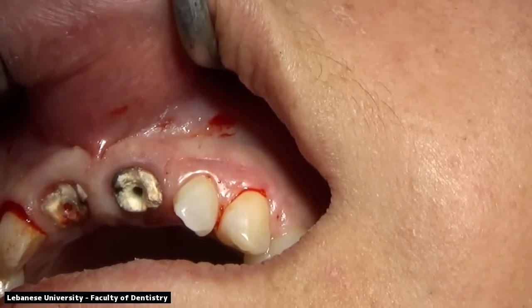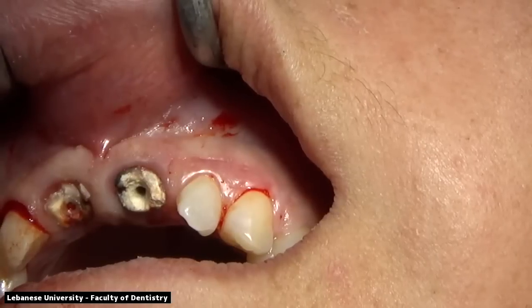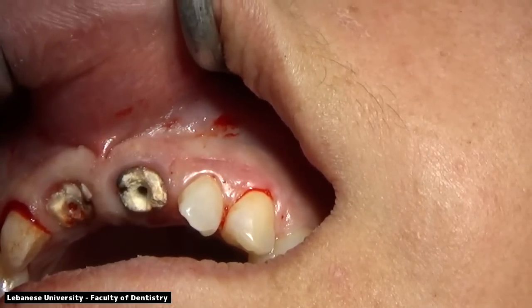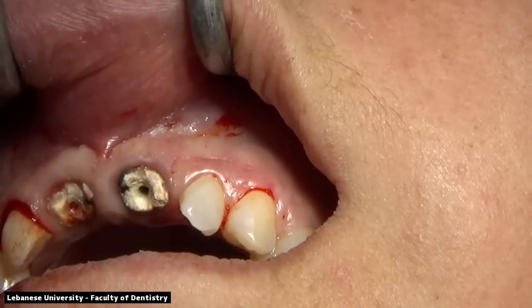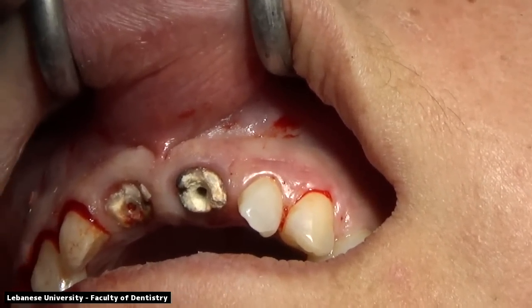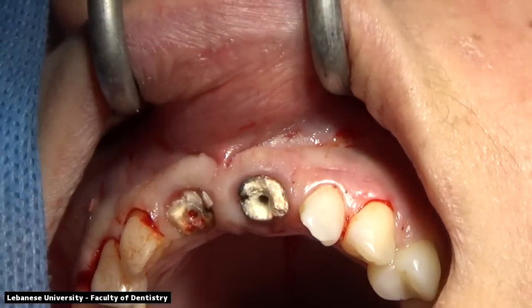We're going to change our blades. Every time the blade touches the tooth, it's going to become dull, so we need to change the blade as frequently as possible to create the clean cut that we created on the right side.